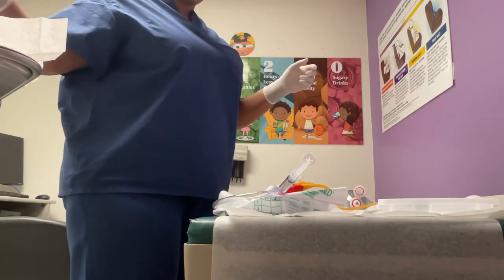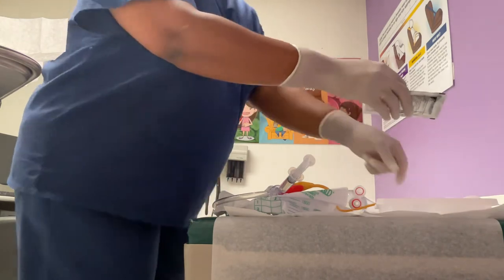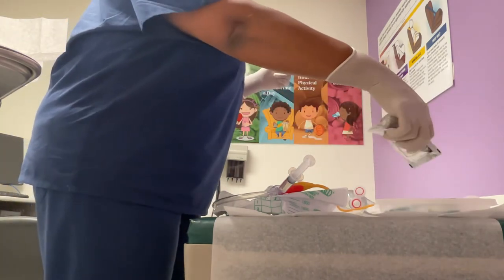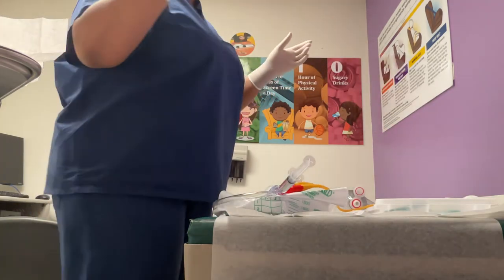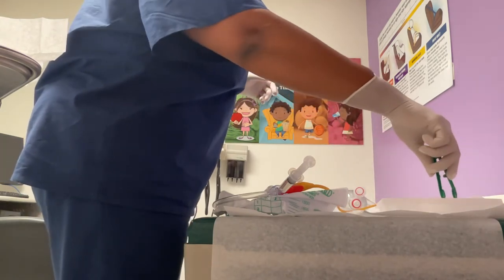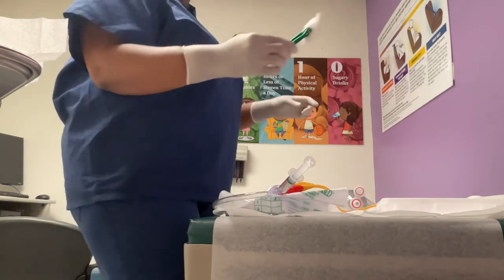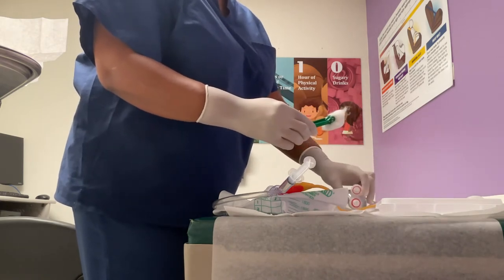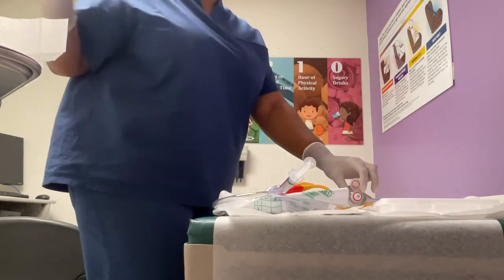We're going to take our iodine and pour it on our cotton balls. Put that to the side — hands above waist, remaining sterile. We're going to pick up our first cotton ball, hold it with thumb and pointer finger, hold the labia apart, wipe one side, and toss.